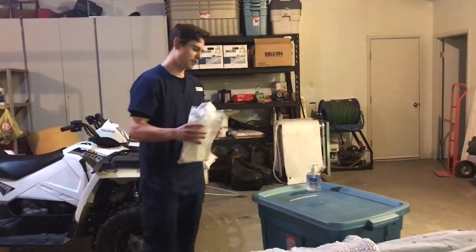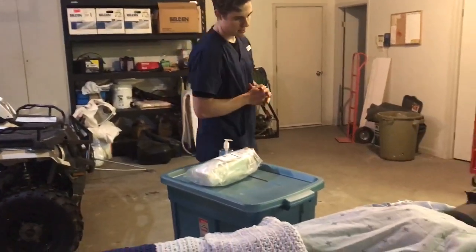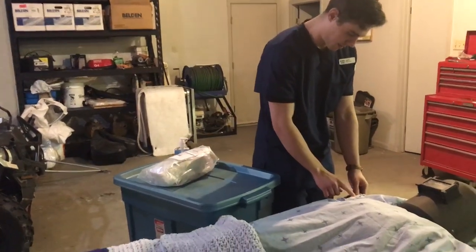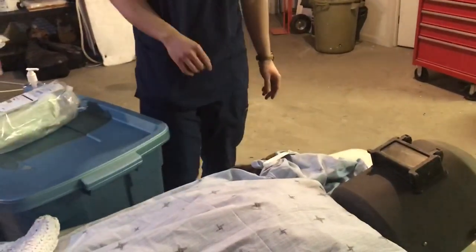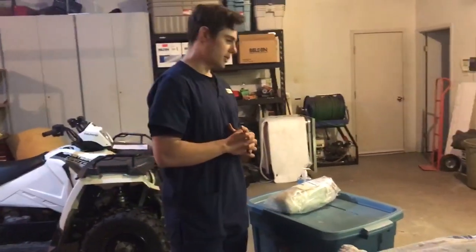After that, I will ask him, could you tell me your name and birth date? Once he does that, I'll verify those 2 identifiers with his wristband here, nursing Jake, date of birth January 1st, 1960. And do you have any allergies? He says he doesn't have allergies, so that's good. After that, I'm going to explain the procedure.